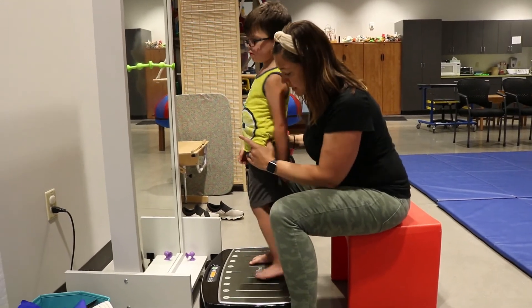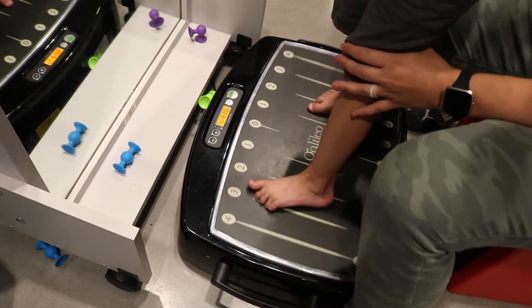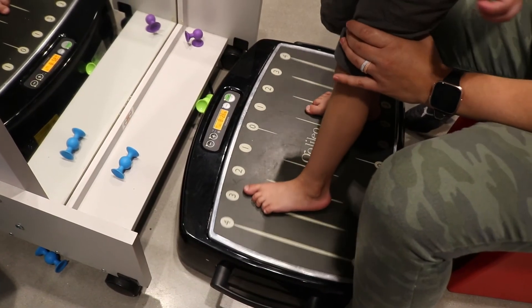All right, you ready buddy? Let's turn it on. Stand up nice and high.